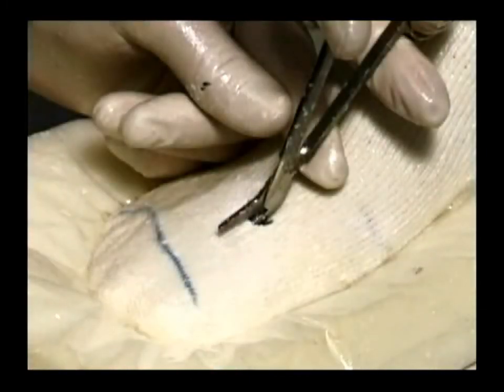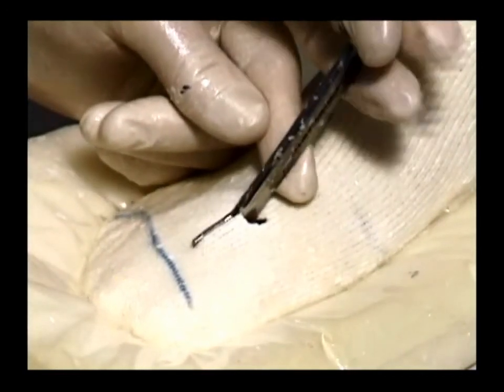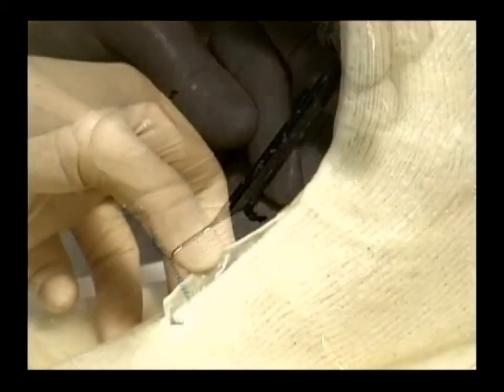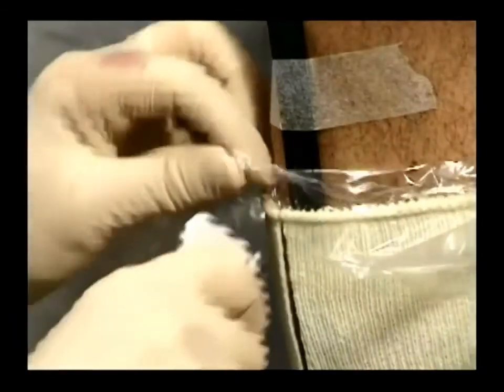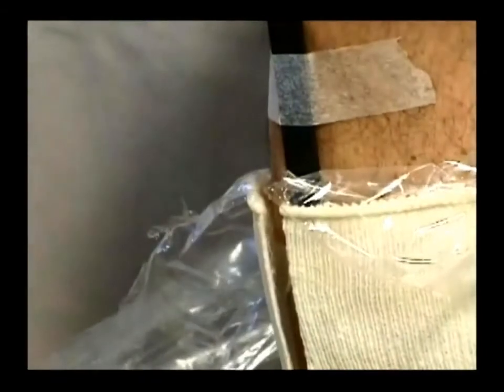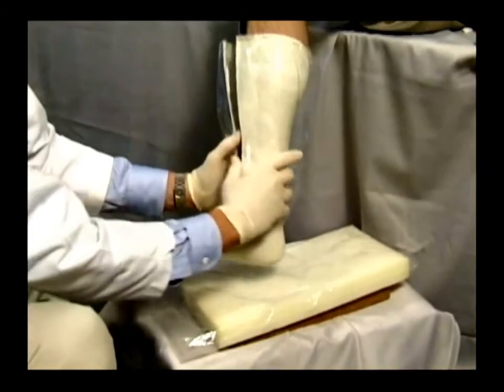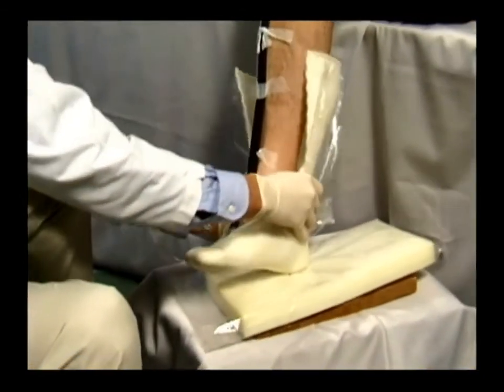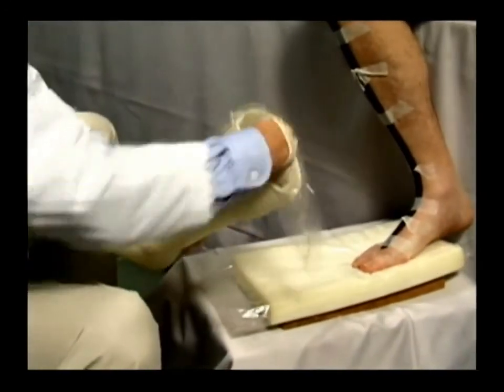Next, reversing direction, cut from the starter hole to the colored stitch line between the first and second toe, again gently elevating the sock material away from the skin as you make the cut. Check the cut line to make sure the underlying bag has been cut through its entire length. If sections of the bag were not cut, complete these cuts before proceeding. You will need a continuous, unobstructed opening to remove the cast. Gently spread open the mold with your thumbs and remove it from the patient's foot by rotating it around the heel. Depending on preference, tuck the plastic bag inside the mold or carefully remove it.